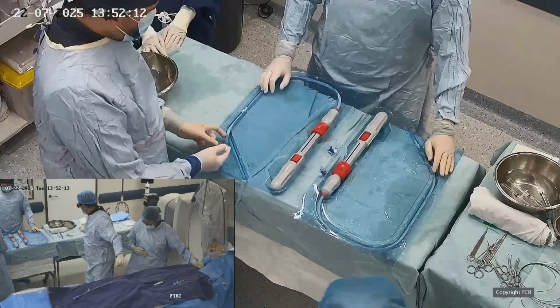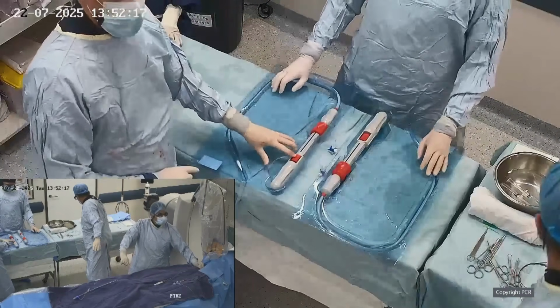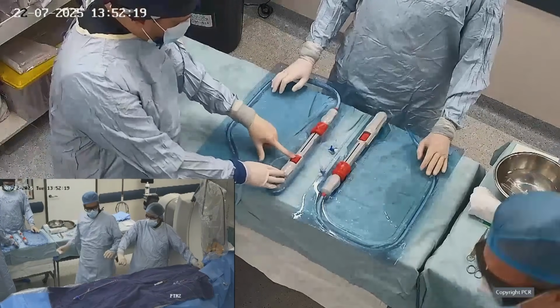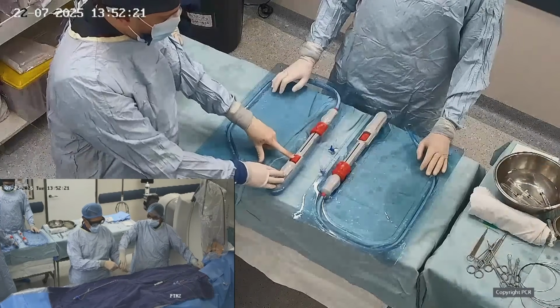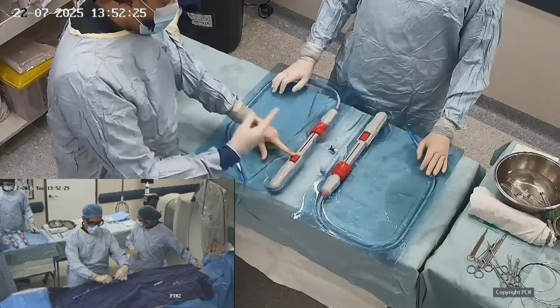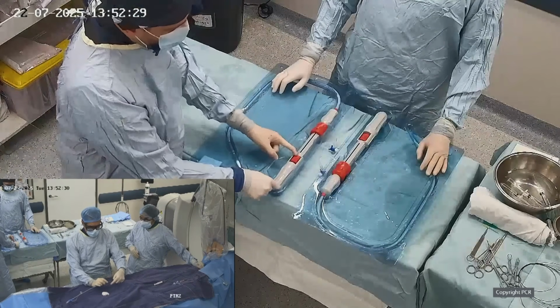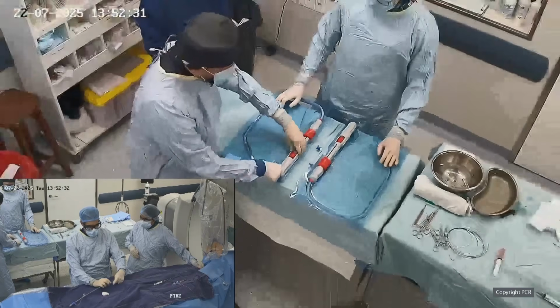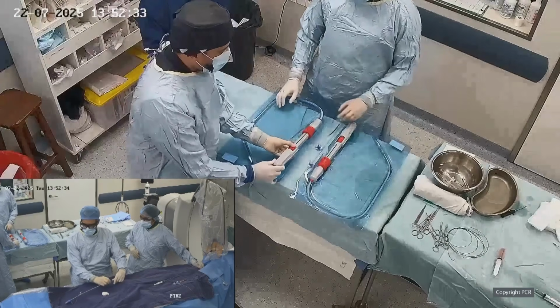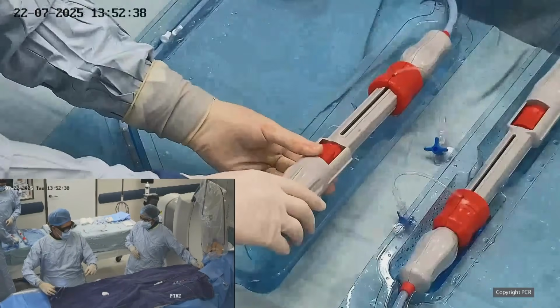The way that you are going to release the valve, we are going to show you perfectly, is by moving this scroll, the red scroll, turning it clockwise, and then you have a sort of lock to try to recapture the nose cone when you finish using it.